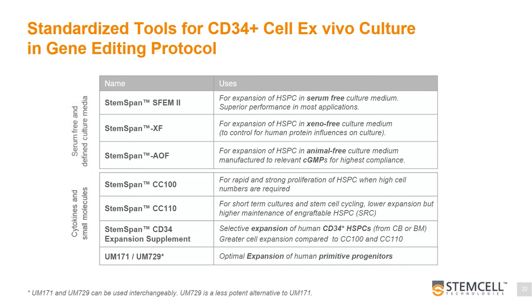We evaluated 3 different serum-free hematopoietic media: StemSpan SFEM2, XF, and AOF. The difference between the media is the level of compliance from serum-free through xeno-free to animal-free. The media were tested in combination with 3 different expansion supplements: CC100, CC110, and CD34 expansion supplement, which differ in regards to early-acting cytokines. Additionally, supplementation with small molecule UM171 was evaluated to promote optimal maintenance of HSCs during ex vivo culture.